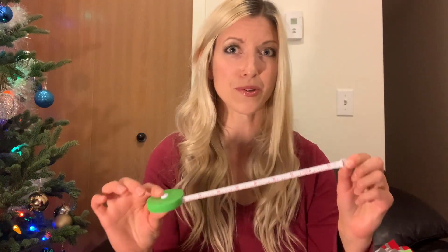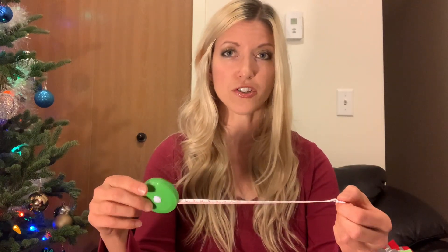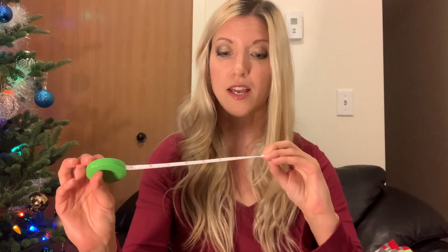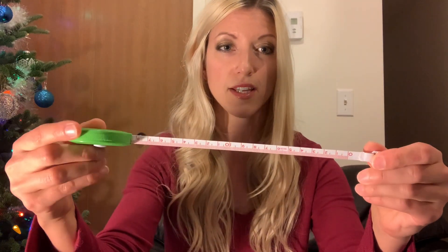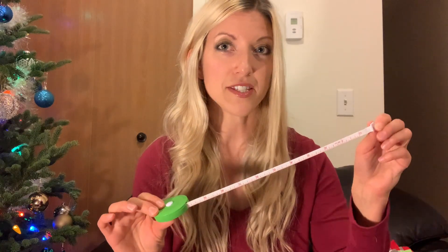I found this awesome little measuring tape at Hobby Lobby — it was only 99 cents. Otherwise you can find these on Amazon as well. It's a pretty good quality tape measure for the price. It has inches on one side and centimeters on the other, and it has a little button to retract it when you're done, so it's reusable. I would definitely recommend this little measuring tape for taking your measurements.